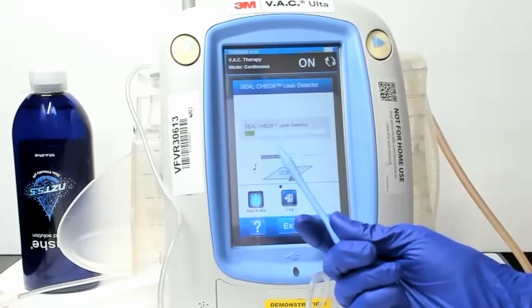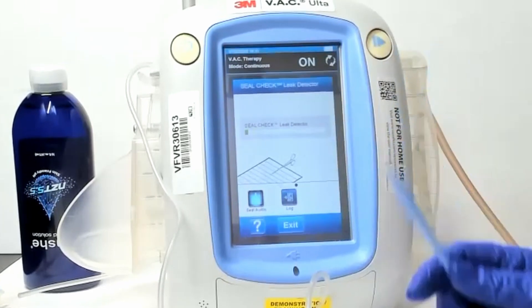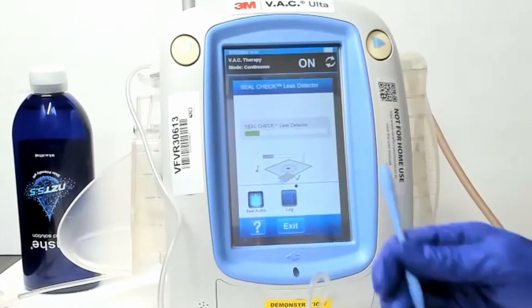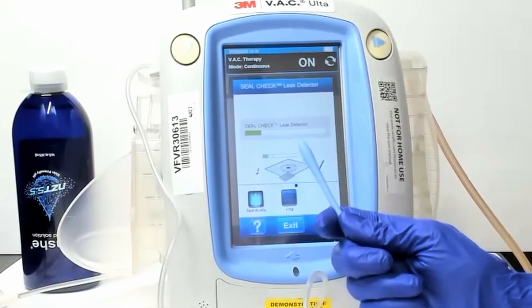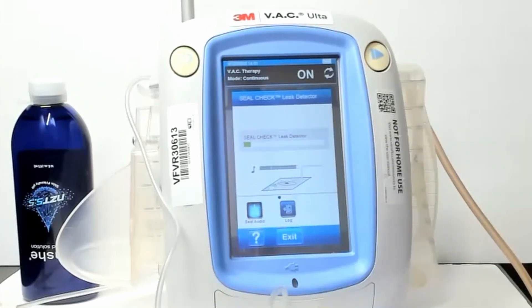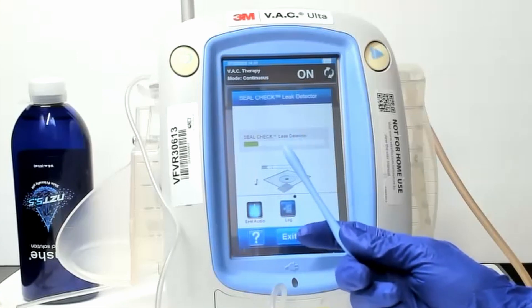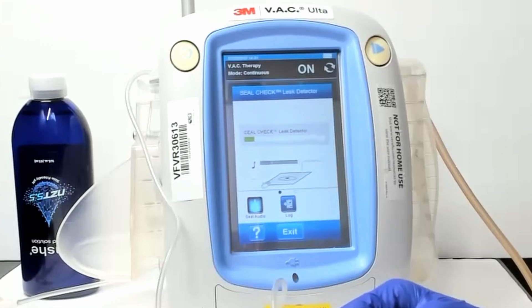A lot of times people will leave this pump on the floor, but really this seal check bar is super helpful to figure out where on the dressing the leak is. As you move your fingers around, the leak will get less and less, and then all of a sudden you're like, 'Oh, I found the spot where the leak is!' So make sure when you're setting up for your seal check, get the pump up on the back side of the bed or on a bedside table so you can really take a look at that seal check as you're pushing down on the edges of your dressing to make sure you have a nice seal.